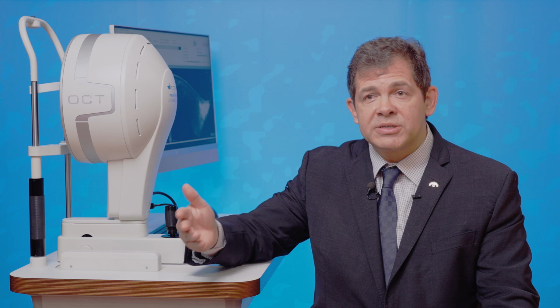When you think about the epithelium in terms of ectasia progression, as my colleague and friend Dan Reinstein indicated in his laws of epithelial modulation, we have a reaction. So the epithelium reacts to something that's happening. And maybe Bowman will be an early sign of that. But I still have to learn from studies so that we can really have a conclusion. But we have a good hypothesis.